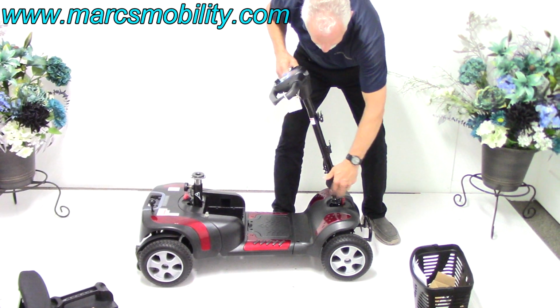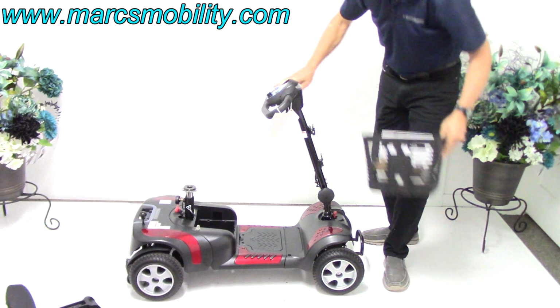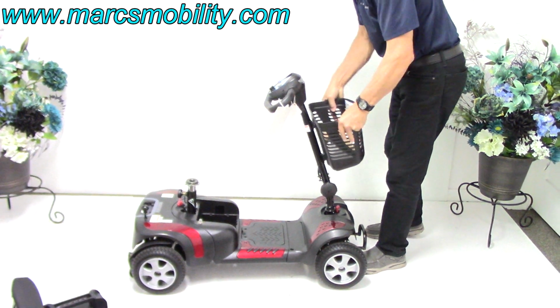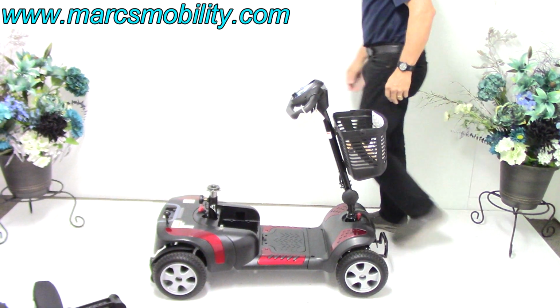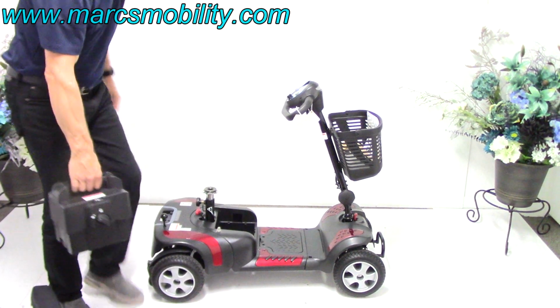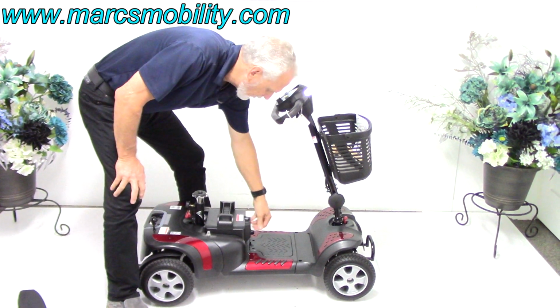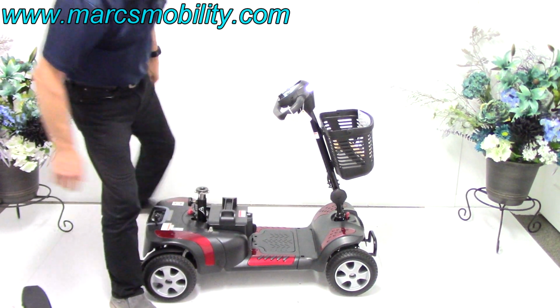Put the tiller back up. Put your basket back on. Put the battery pack back in. Lock your battery pack so it doesn't come out.